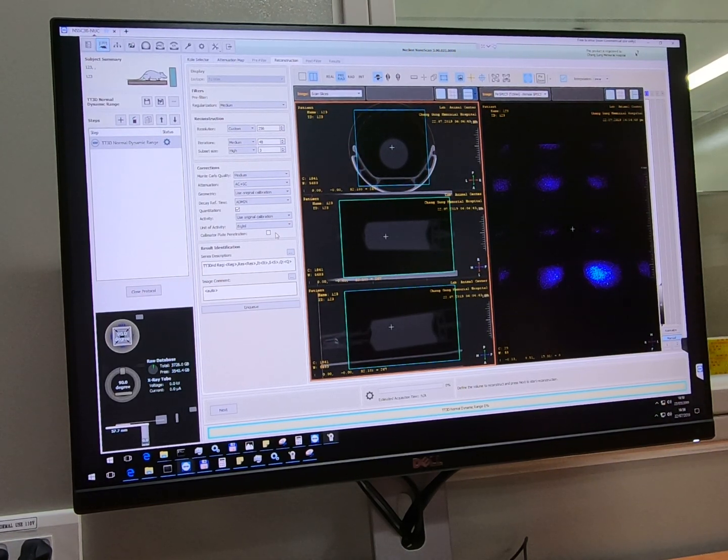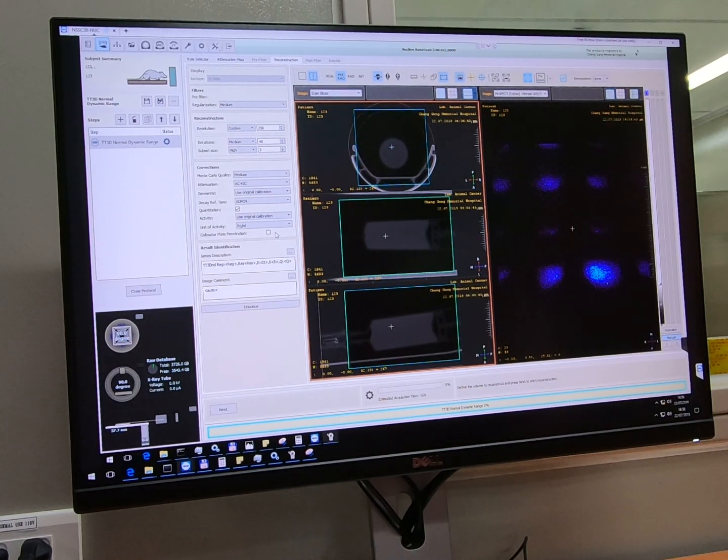which means higher than 300. If we don't choose the high, or use, I don't know if you use the high energy isotope, but in the reconstruction we don't select the high or what? I don't really understand what the question is.